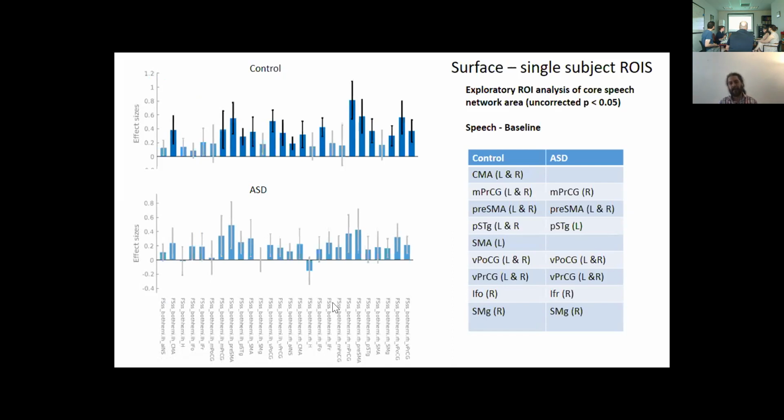Yeah, the thing is, sometimes when you define the ROIs for a particular analysis, you might specify multiple sources or multiple atlas files, for example, and you want to do the analysis across multiple of those ROIs that are defined through different files. So when the toolbox is extracting the information for every ROI, it's prepending the file name, so that when you have the same label through two different files, you don't have any collision, like having the two names twice. But in the case of just having a single ROI file, it doesn't make sense to add that.